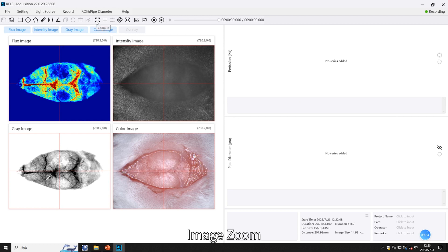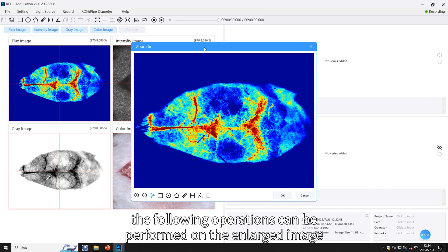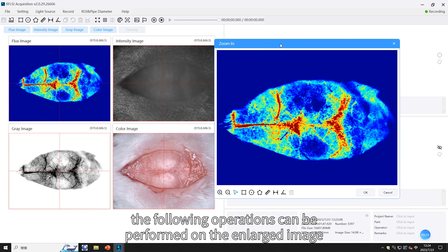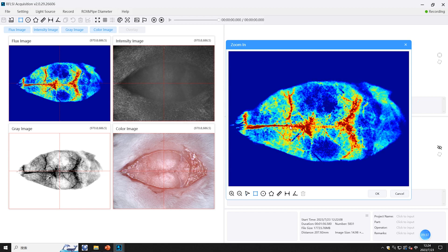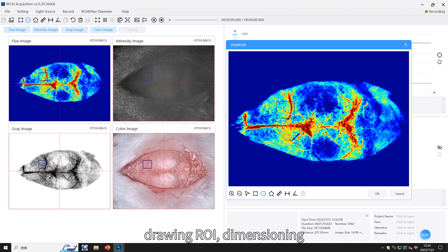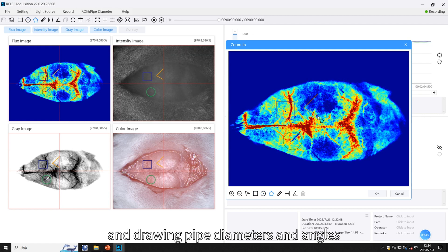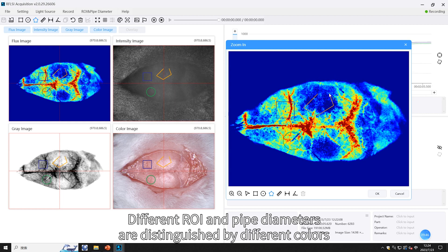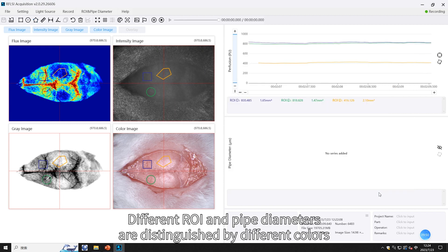Image zoom allows you to zoom in on the image in any one view. On the enlarged image you can perform the following operations: zooming in and out, drawing ROIs, dimensioning, and drawing pipe diameters and angles.